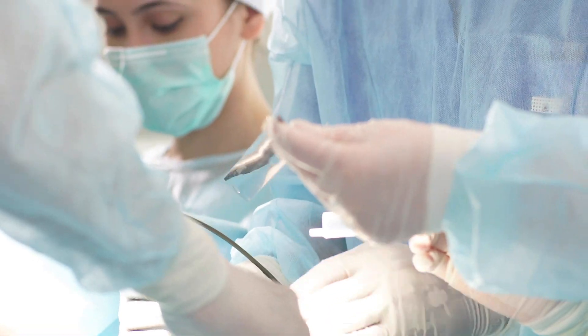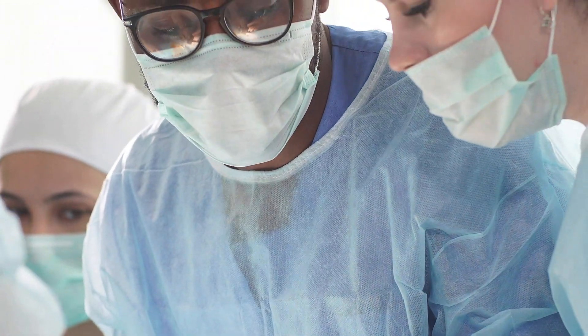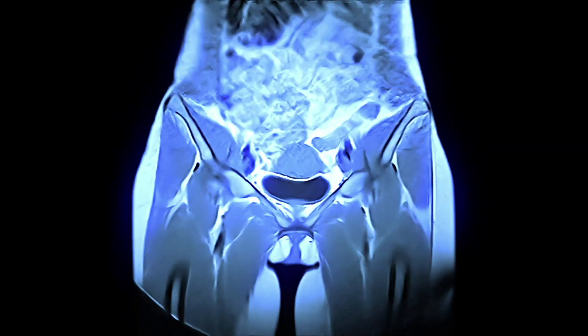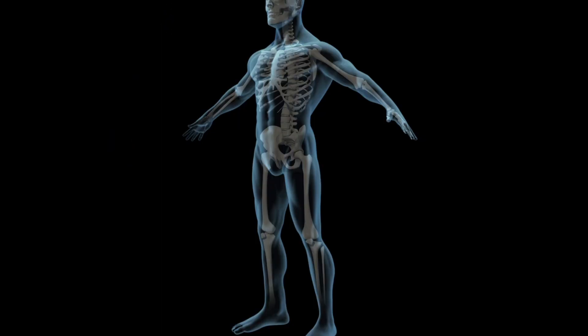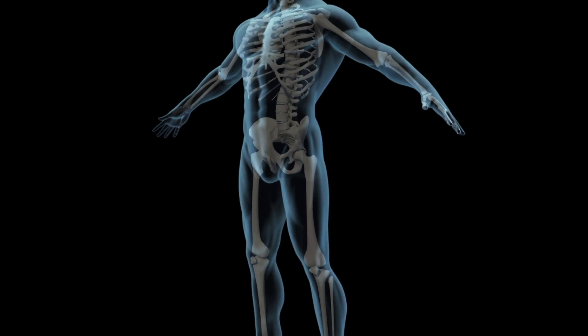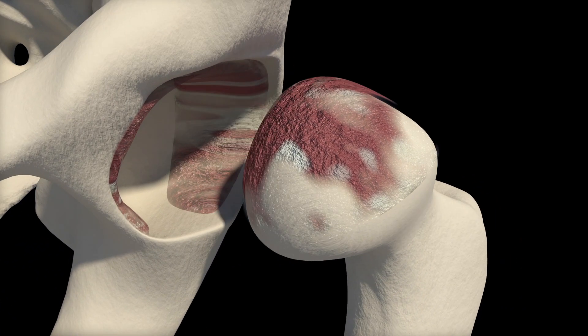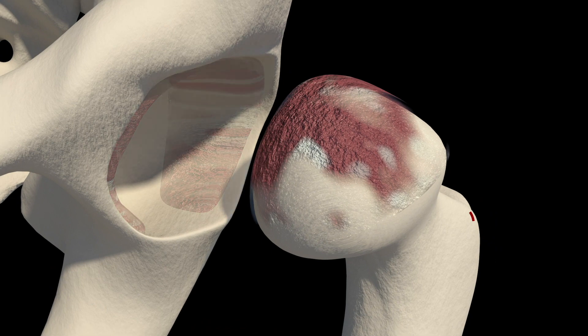During a direct anterior total hip replacement procedure, patients lie face up on a specialized table to help position the prosthetics more accurately. The surgeon may utilize a fluoroscopy machine. Considered minimally invasive, the operation starts with an incision near the patient's groin, usually between three to six inches. After incising the joint capsule, the surgeon removes any damaged cartilage or bone within the acetabulum.